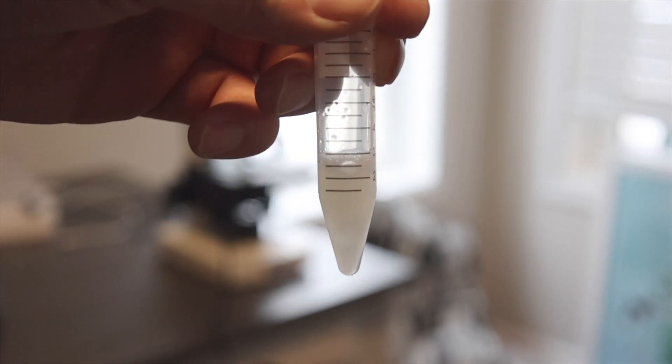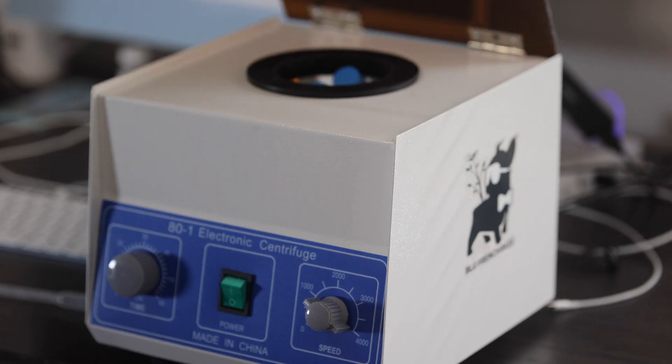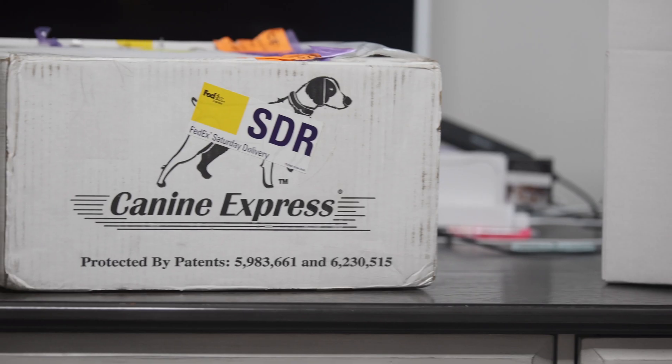The basic steps involved consist of collection, evaluation, centrifuge, extend, and ship.